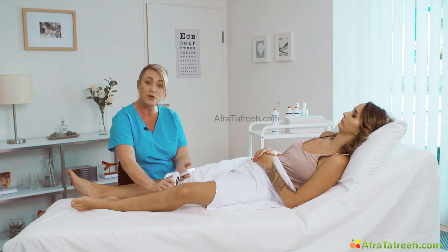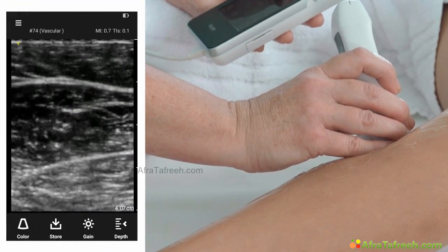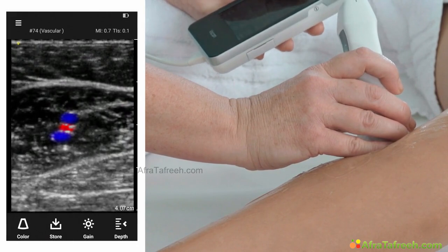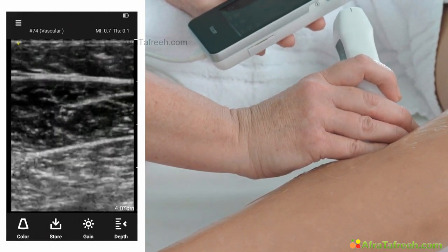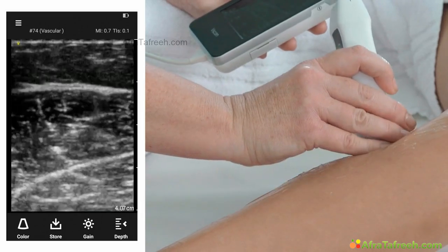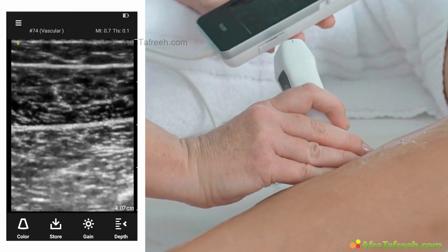Even though our gastrocnemius veins are not typically part of our DVT study, a patient presenting with pain in the calf can also indicate they may have thrombus in those vessels. So if you place the transducer in the proximal calf region here, posteromedially, within the muscle belly here, we're going to see if there is any thrombus in these gastrocnemius veins, again just by compressing to make sure that the veins coapt.